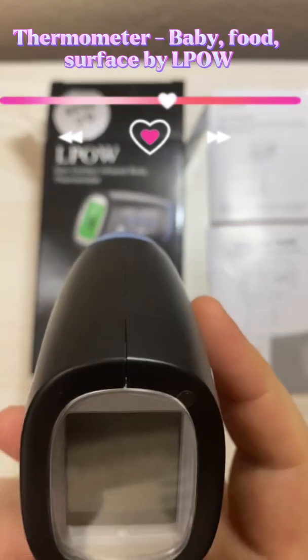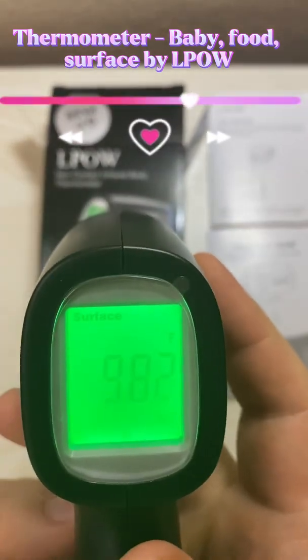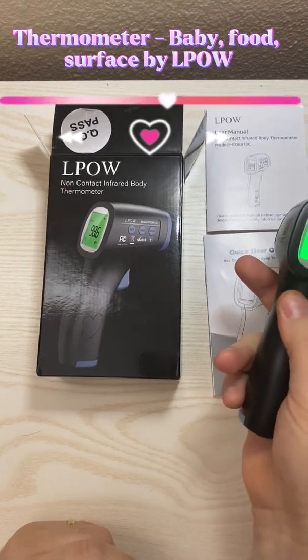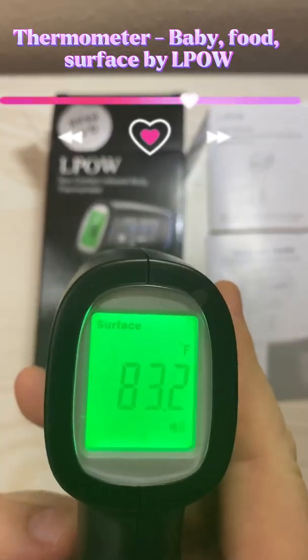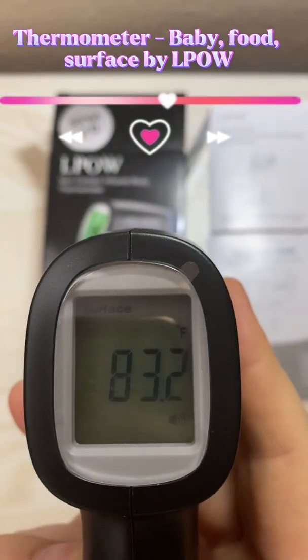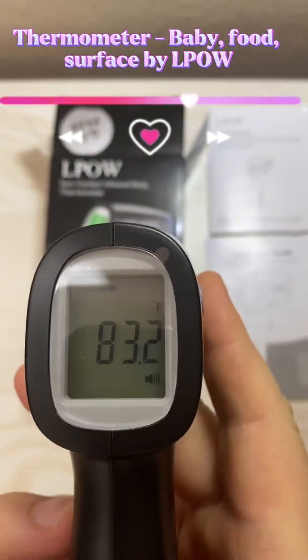I'm going to go ahead and switch to surface mode, as you can see there. Measuring the surface of this — you want to be about one to five centimeters away. You can see I have my thermostat set in the house at 83, so 83.2. That's accurate, definitely.